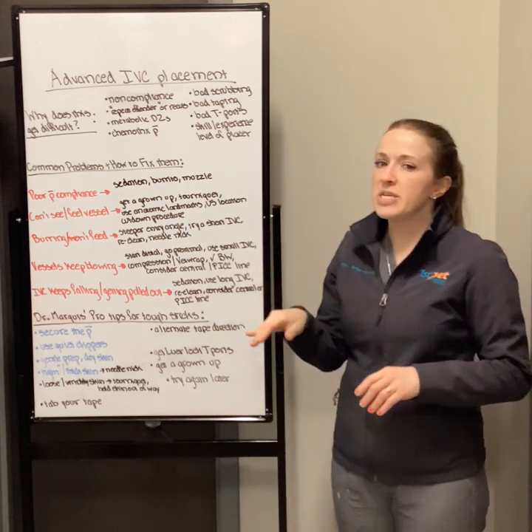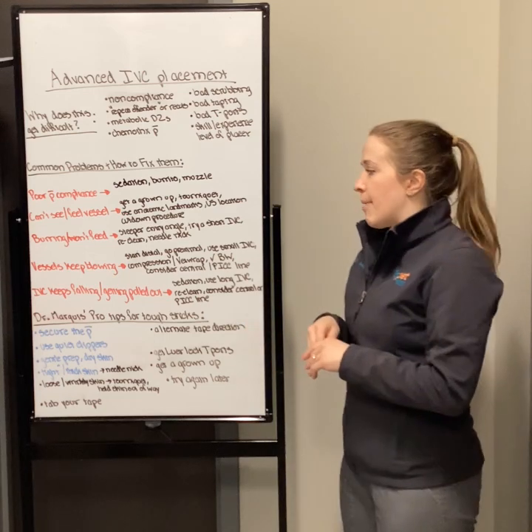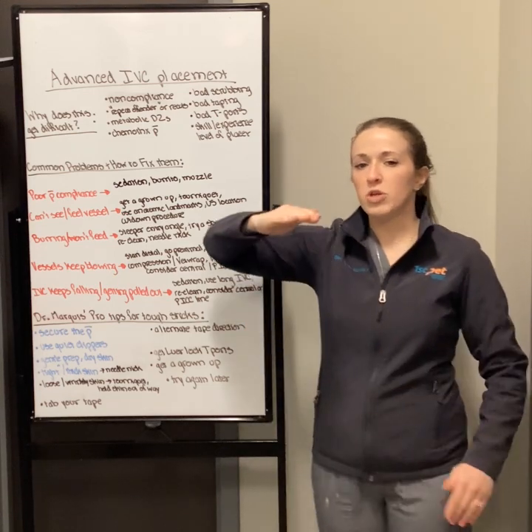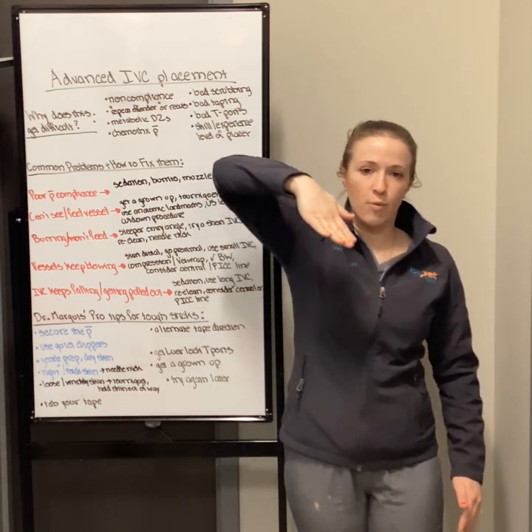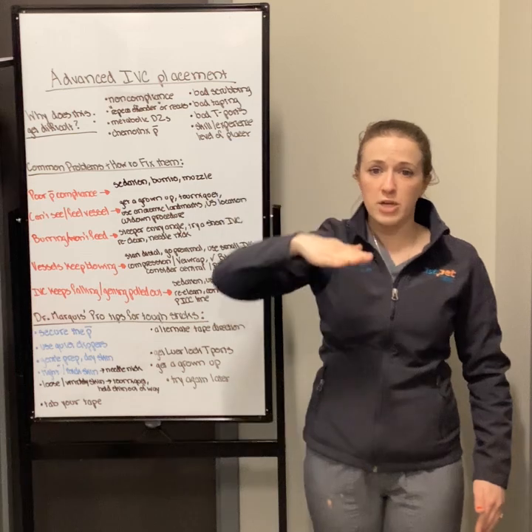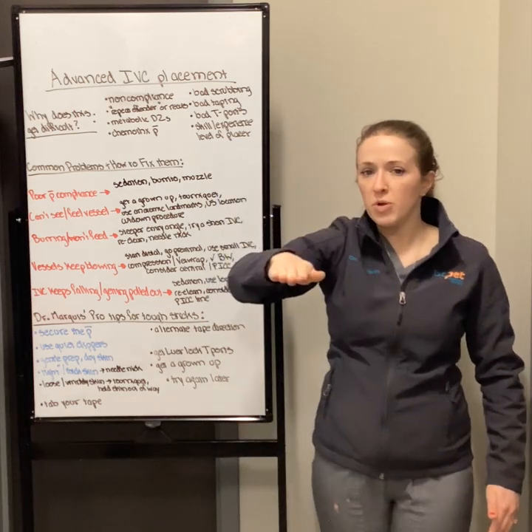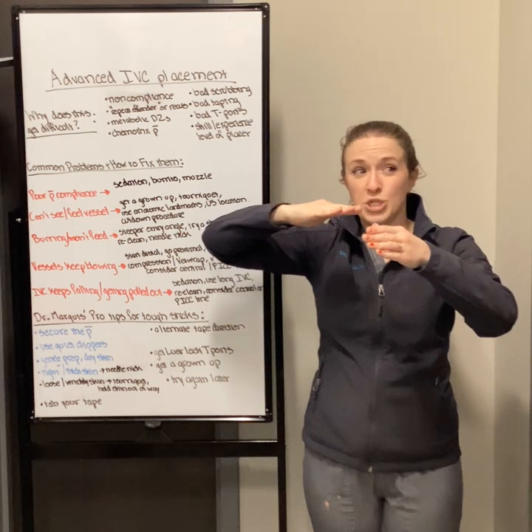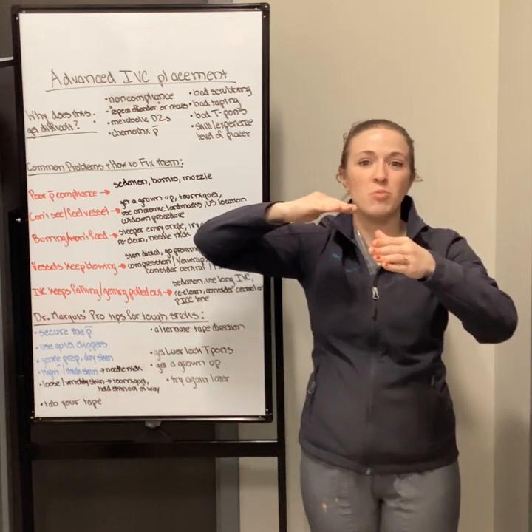The most common reason that catheters burr is if you don't enter at a steep angle. You should be entering the skin at at least a 45-degree angle to get into the vessel. That way you go right through and then you can level out. Now, if you go level with the vessel, instead of going through the skin, you're going more just into the skin, passing more and more into it.